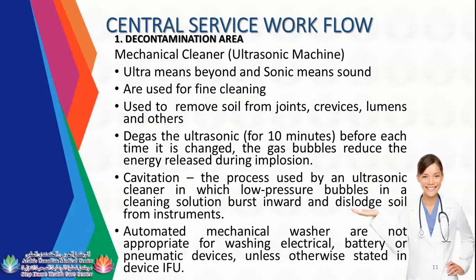Before we use the ultrasonic machine, once we fill the tank with water and chemicals, we need to degas the ultrasonic for 10 minutes, or 5 to 10 minutes, or 30. It depends. Before each use, after the solution is changed, degas, because the gas bubbles reduce the energy released during implosion. Once you freshly mix chemicals in this machine, you can see bubbles. Degas means you need to remove the bubbles.